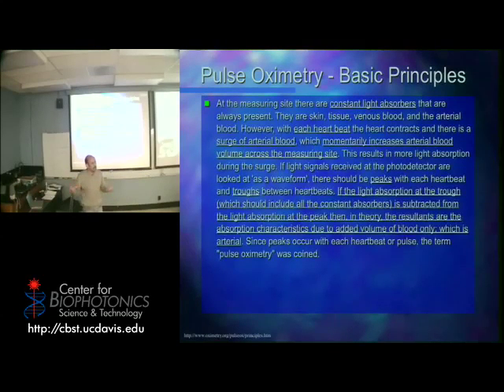You couldn't also just go out and buy a fiber optic readily. All these things were difficult, so you had to have lens systems. It was kind of annoying. It wasn't something you could readily do. But slowly they were able to get the data, and then eventually some of the technology caught up, and then it became easy to do this. Now I've got a student who worked with us last summer who was trying to figure out the health of teeth on animals, on dogs and cats, by having a little device that's a pulse oximeter for the tooth, and figuring out how much blood flow is in your tooth, because a healthy tooth has blood flow. So, now it's pretty easy, in a way.